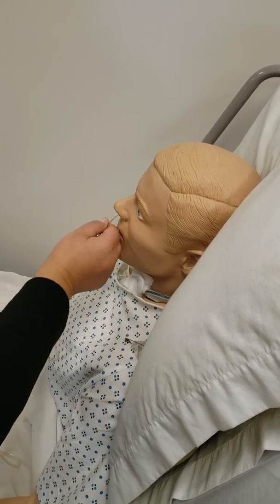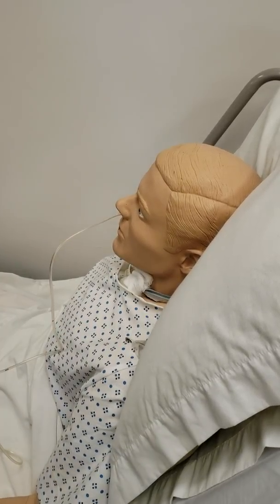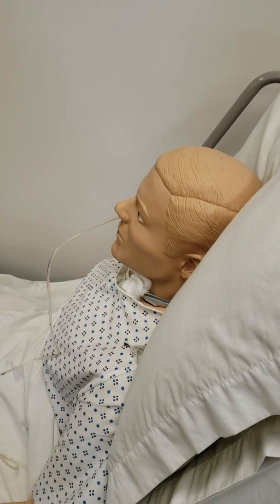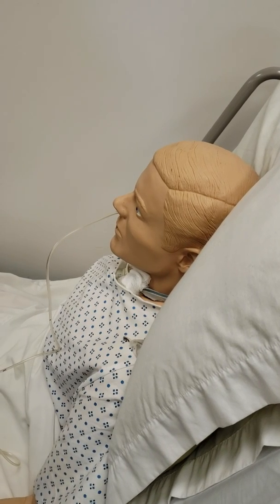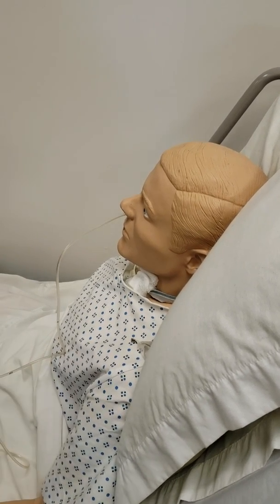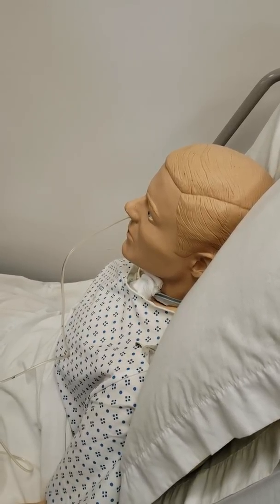I could advance it a little bit more, but I forgot how to measure this. Isn't it that you wrap it around the ear, from here down to here? Yeah, at least until the xiphoid process. I'll watch a video again.